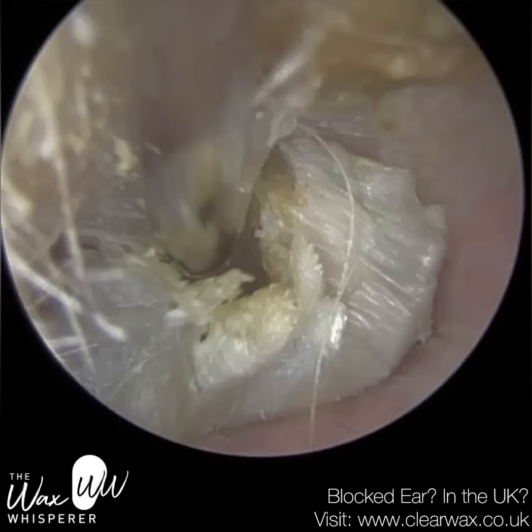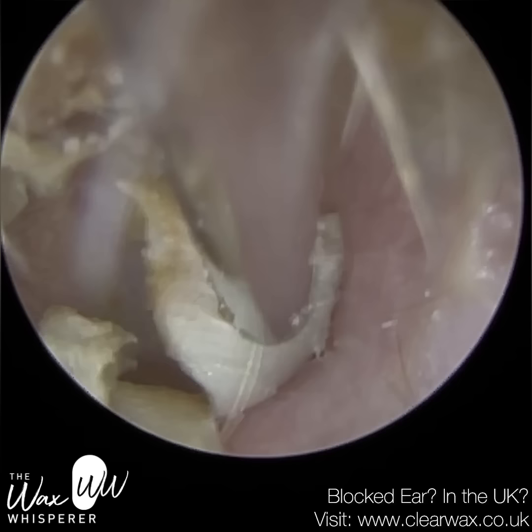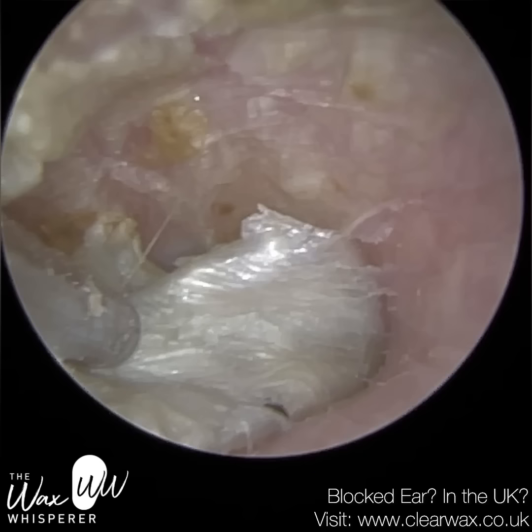So we've completed the right ear. Now in the left ear, I removed that outer plug of dead skin with relative ease, and now I'm just peeling away all this dead skin. Underneath, you're seeing a healthier ear canal which resembles the patient's right side. This patient does suffer from otitis externa.